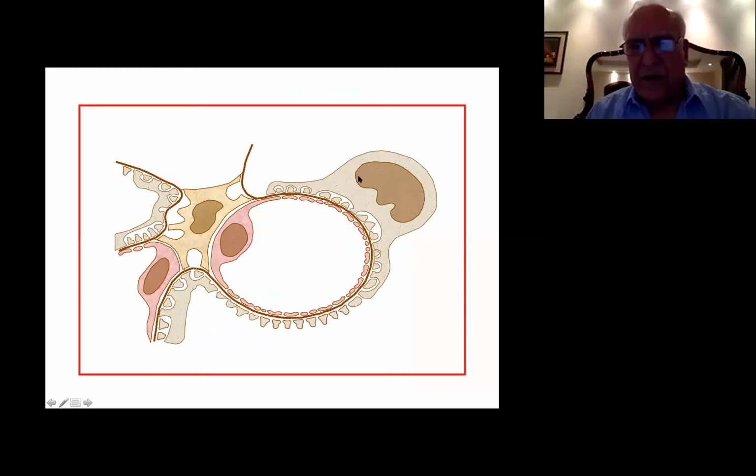We have the outside, the epithelial cell sending its foot processes over the surface, and then we have the endothelial lining, which is the endothelium, sending its cytoplasm into the lumen. And look, it's not a complete layer, it is fenestrated. And that's important for later talk. And this is the mesangium that usually holds several capillary loops together.